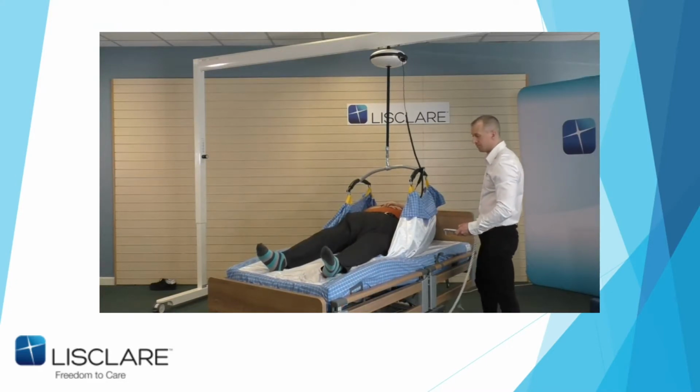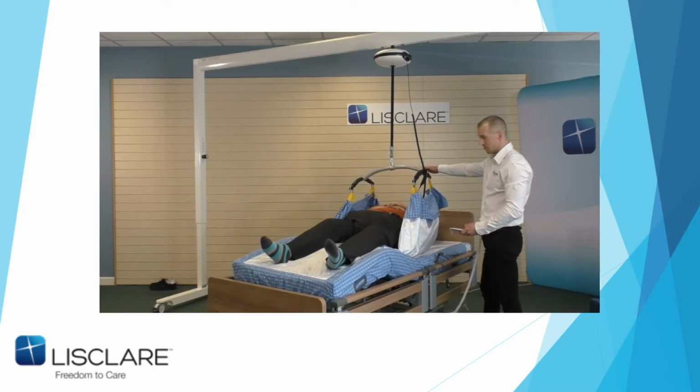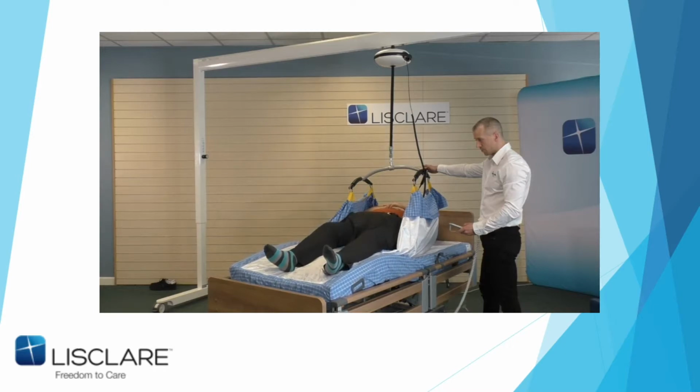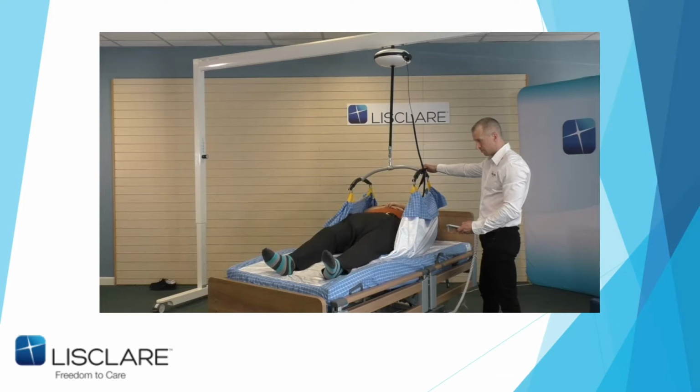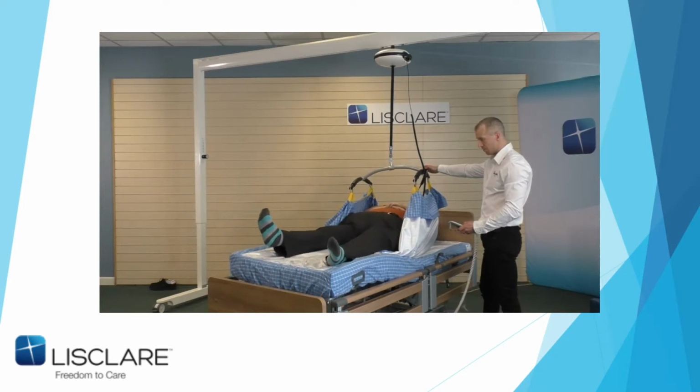We practiced this yesterday, and I even slid up without the need of the hoist because of this thing in the bed. I can feel myself going. So John now just lifts the leg piece up. If you lower down, John, listen for the 3 clicks. And lift again, John. And there's my feet coming up, just to show you, stripy socks.